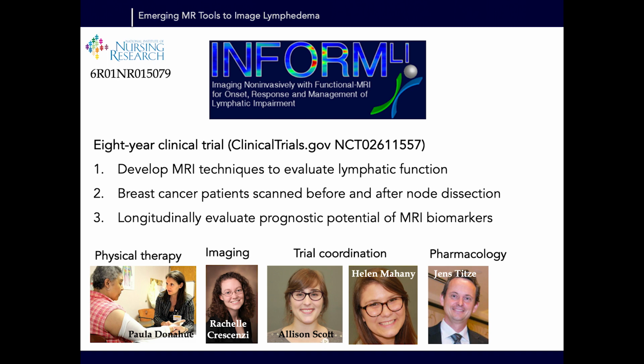And then what we're doing now is we're scanning patients before and after lymph node dissection, so in subclinical stages of disease, also at risk. And then we monitor those patients for several years to see which ones of them develop lymphedema, then go back and see whether any of those novel imaging methods provided prognostic indicators. So we have support from physical therapy, Paula Donahue, imaging, our postdoctoral fellow, Rochelle Crescenzi, clinical trials coordination, also pharmacology. We also have support from radiology and surgery as well.